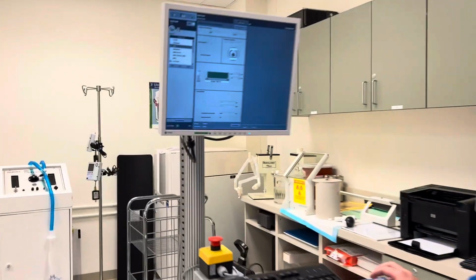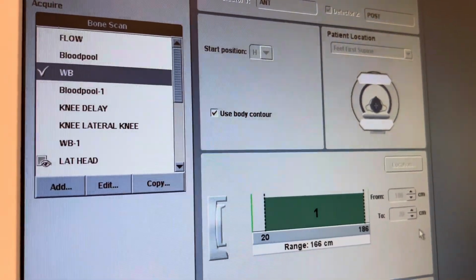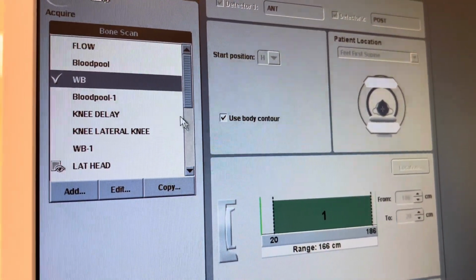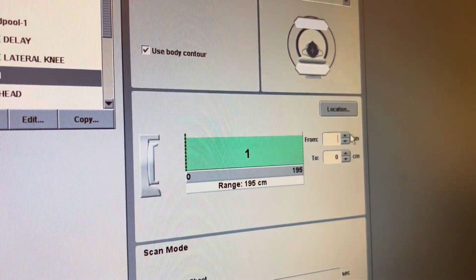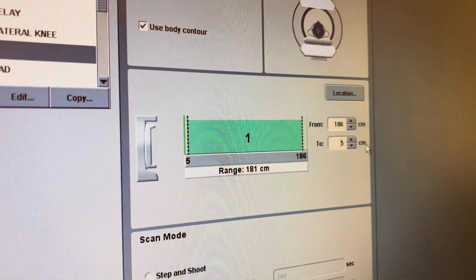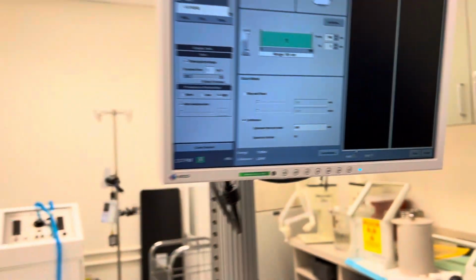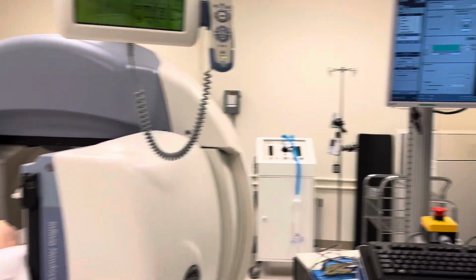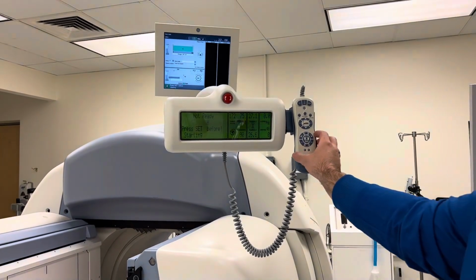So for the whole body picture, we have her field of view set here. So then we would hit apply. I'm on the wrong one here. All right, so we'll hit apply down here again. You're telling your camera you're ready to go. You have your ROI set. And from here, we can hit set again, and it'll place Rosie in the right position.